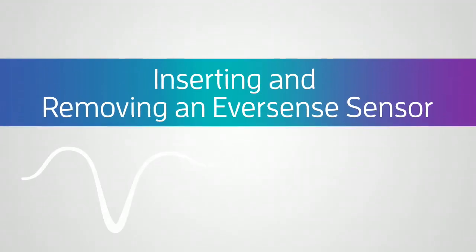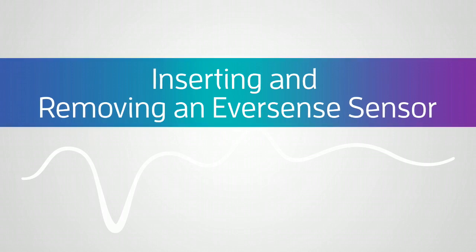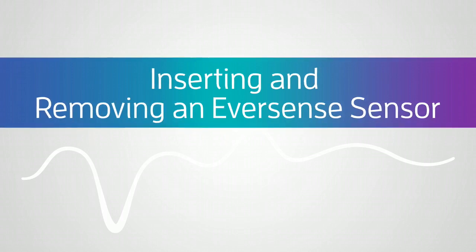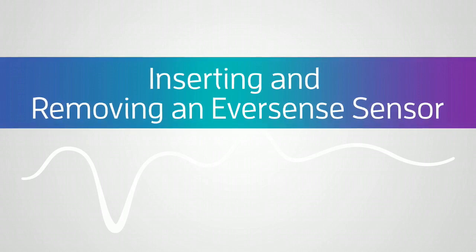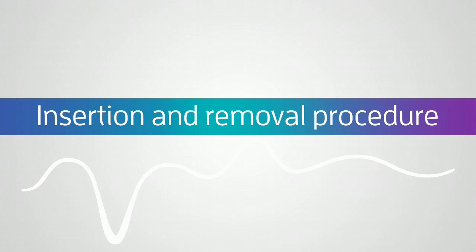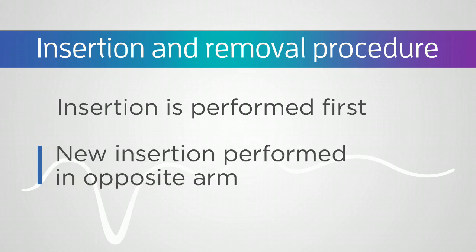This presentation will demonstrate steps on how to insert a new Eversense sensor and remove a previous sensor. It is intended as a training supplement only and is not a substitute for training with your authorized Eversense trainer. When performing an insertion and removal procedure on the same patient, the insertion is performed first. Also, make sure the new insertion is performed in the opposite arm.